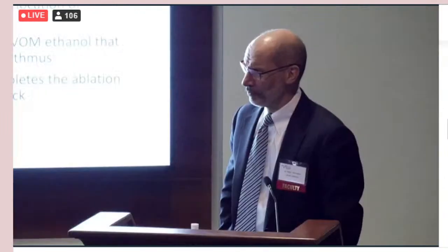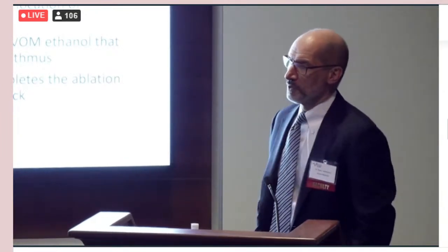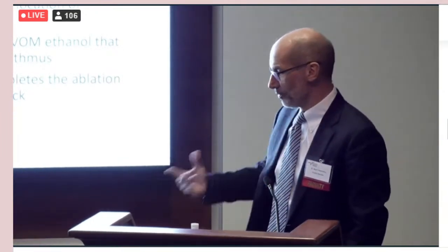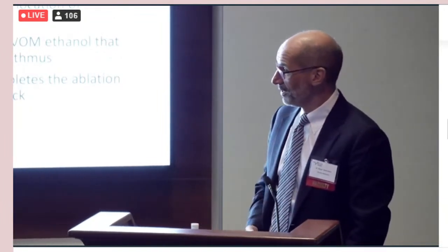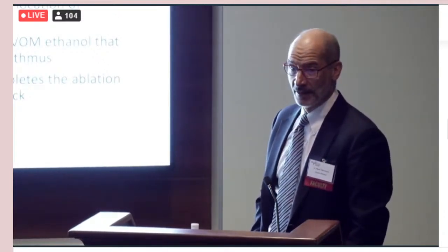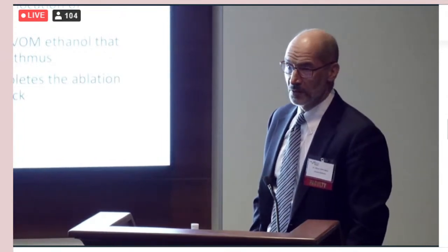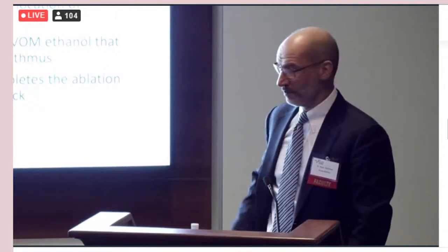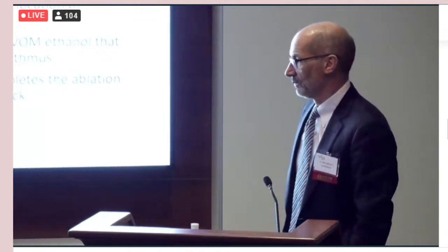How do I circumvent what? Difficulty pushing contrast. No, I have not had that. When you inject once and you inject contrast after, you will see myocardial staining, but it doesn't get harder to inject. Is that what you're talking about? That's what the question was. No. I used to flush it more compulsively. I just go alcohol, contrast, retract, alcohol. You just have to push really hard, I think.